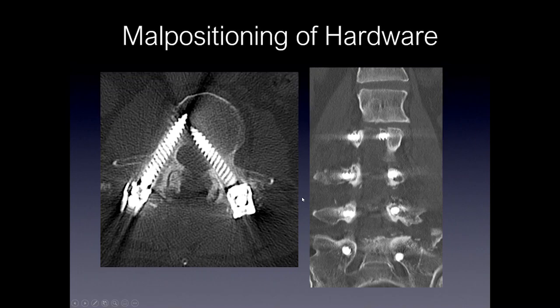Malpositioning of hardware is another important complication to be aware of. You want to assess where all the screws are and if they're appropriately located. You can see this right pedicle screw is in its normal course — within the pedicle along the lateral aspect of the pedicle wall and the lateral aspect of the vertebral body. On the left side, the screw is penetrating more medially into the medial aspect of the vertebral body, and it's along the lateral aspect of the spinal canal because it has penetrated the pedicle. On the coronal, you can clearly see the screw displaced medially within the spinal canal — multiplanar reformats are important here.